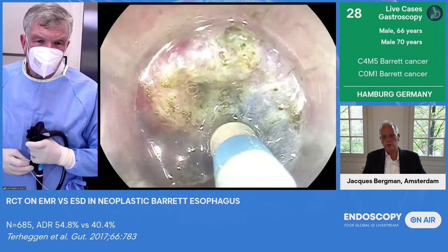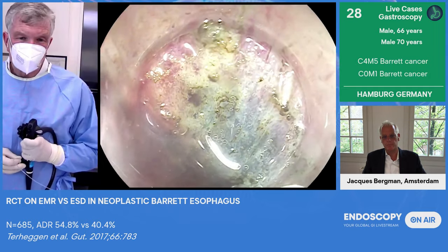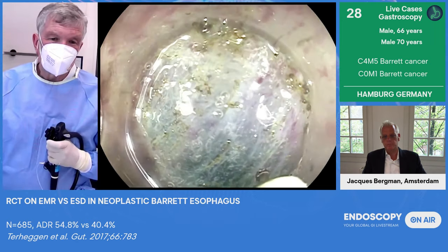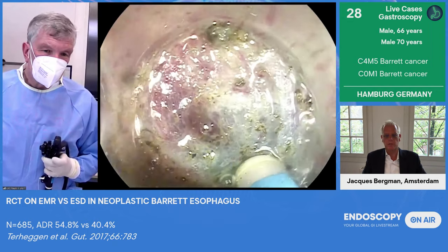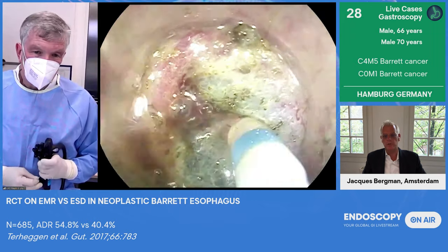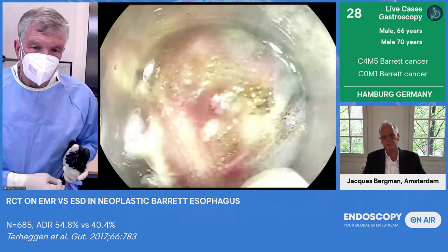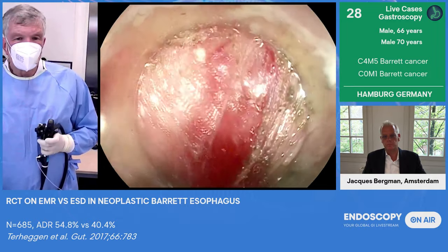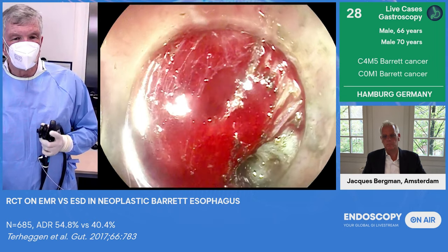So Thomas, can you just show the audience how the knife looks when it's out so that they understand what the difference is? Here, I can work with this as well. But this is a 1.5 millimeter dual knife. If you're in a tricky area, you can close the knife and only use the closed knife to be very delicate, like you were demonstrating. Yes, exactly. It takes a bit longer, but as you can see here, if you see this only, you may say, okay, that's submucosa, but it's clearly not far enough if you compare it to the right side.